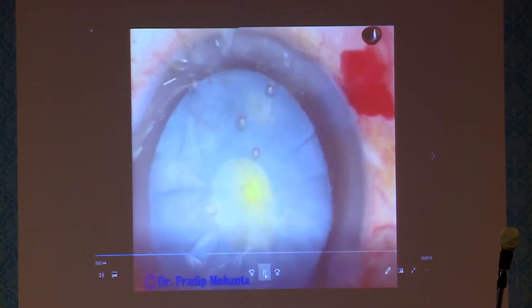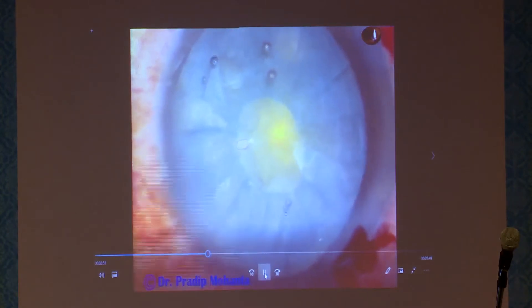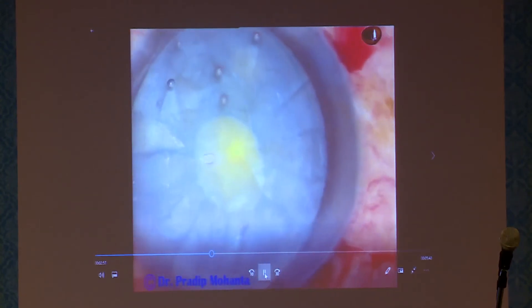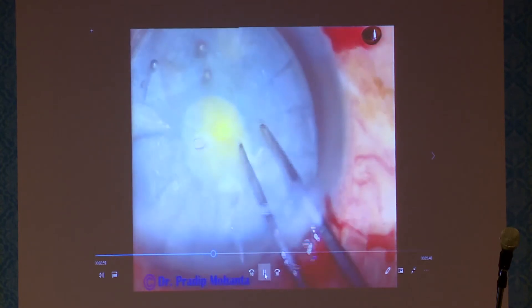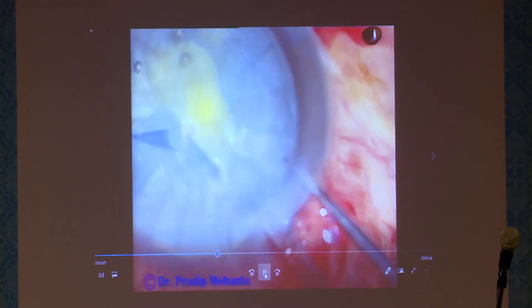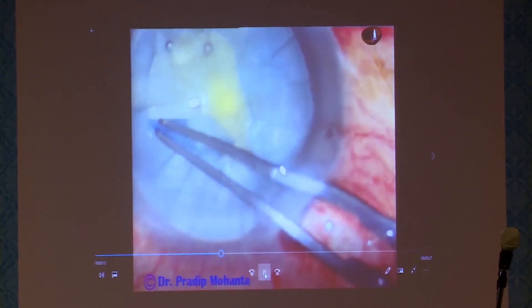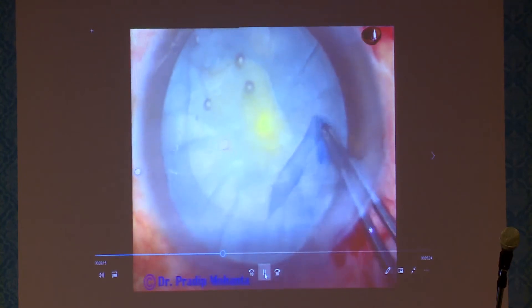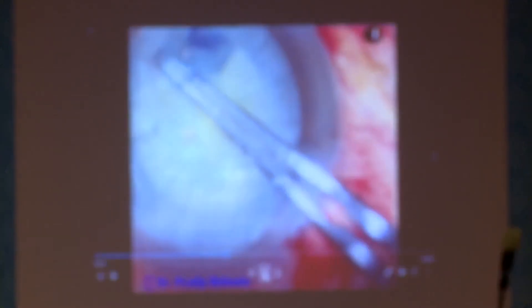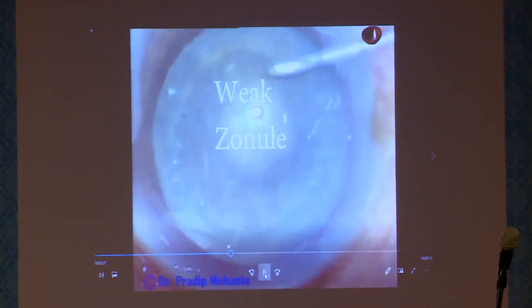How to enlarge the rhexis? It is very simple. Inject viscoelastic substance, take a Vannas scissor, and make a small cut somewhere where you are comfortable — I make the cut at around 7 or 8 o'clock. Then use utrata again and enlarge the rhexis. This time the capsule behaves totally differently; it doesn't tend to go to the periphery. So the trick is: always aim a small rhexis first, reduce the intralenticular pressure, and then enlarge the rhexis.